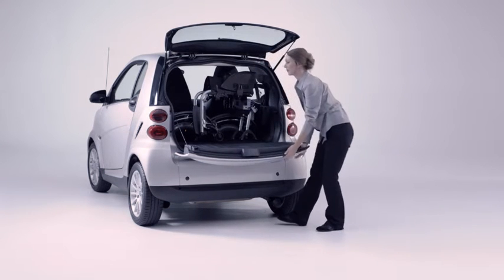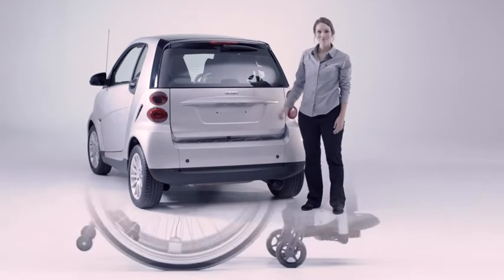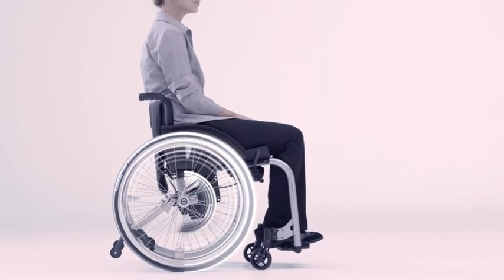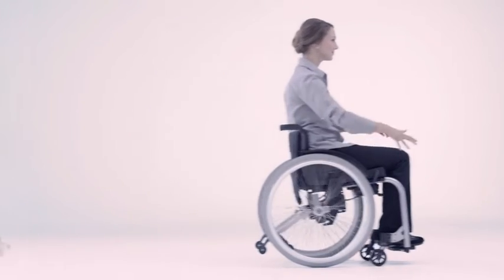eMotion is ready and waiting to go in a matter of seconds. The highlight: the wheelchair can still be used as a normal manual wheelchair. Just couple up the conventional wheels and you have two wheelchairs in one.